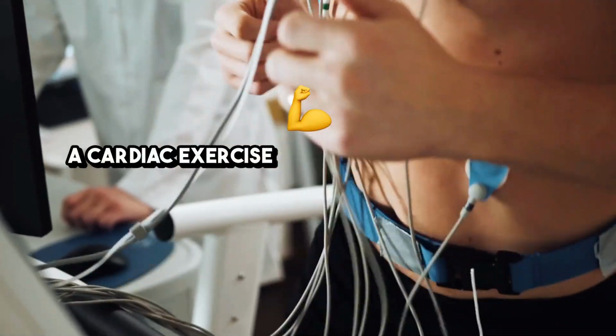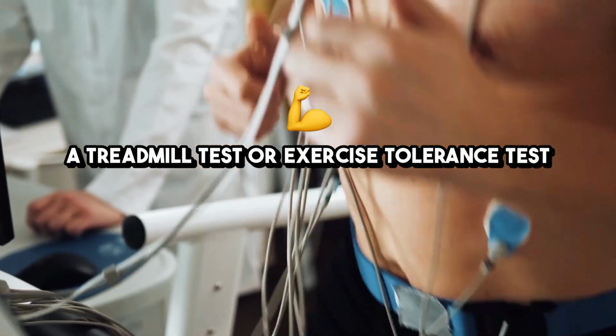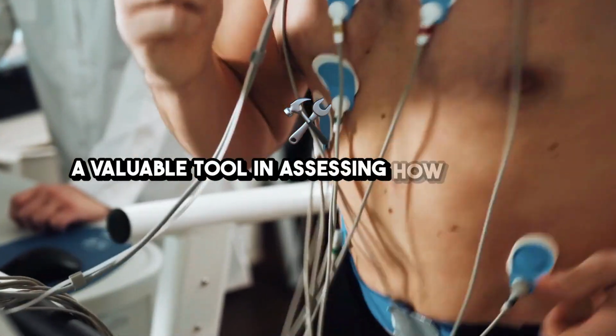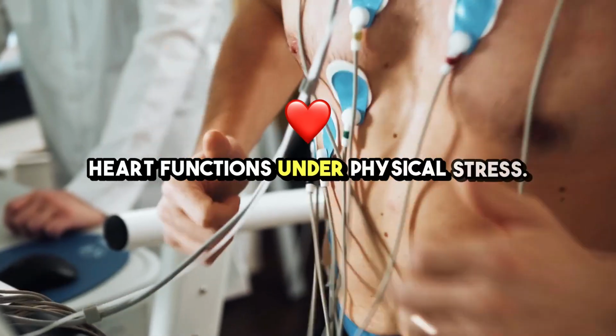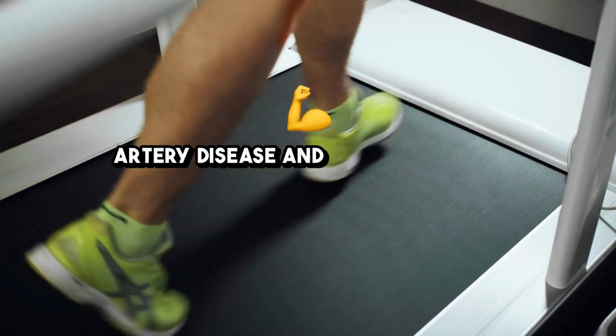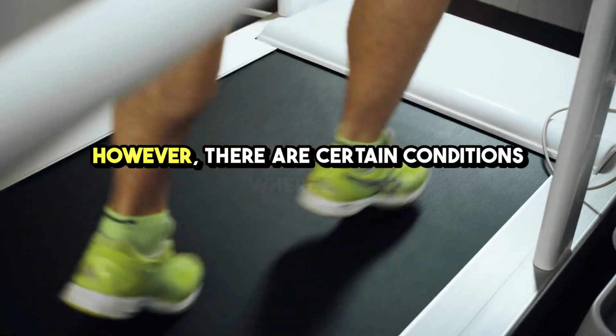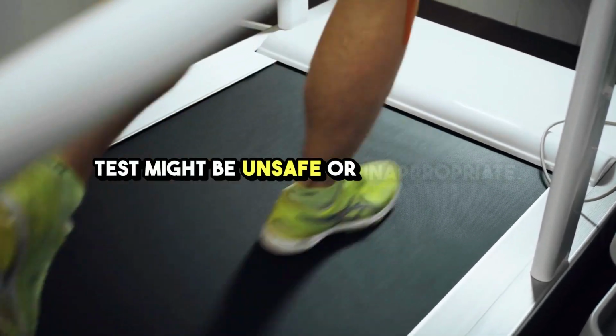A cardiac exercise stress test, also known as a treadmill test or exercise tolerance test, is a valuable tool in assessing how well the heart functions under physical stress. It helps diagnose conditions like coronary artery disease and assess exercise tolerance. However, there are certain conditions where this test might be unsafe or inappropriate.